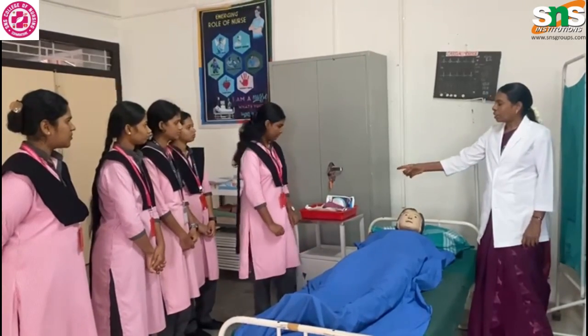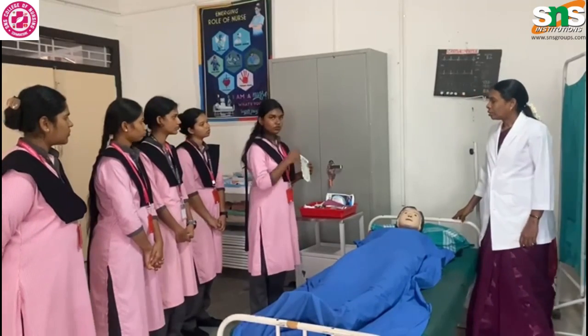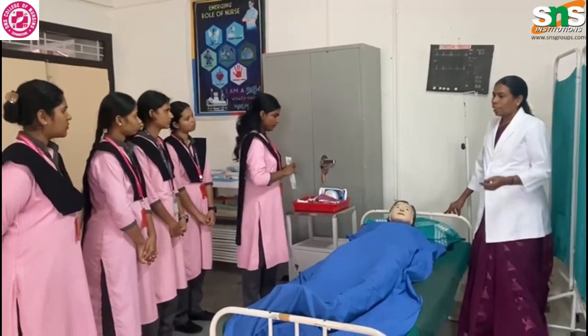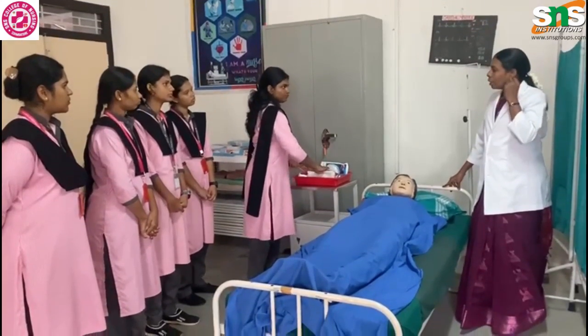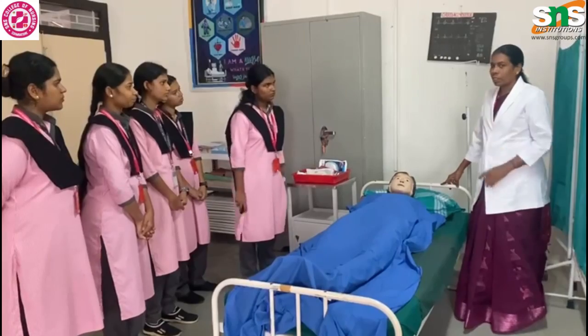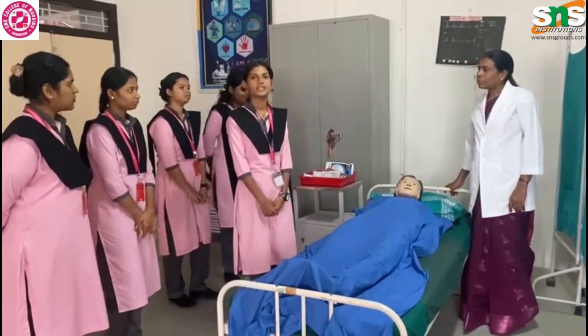Then how will we measure the NG tube? We will be measuring the NG tube from nose to earlobe and from earlobe to xiphoid process. Yeah, that is tip of the nose to earlobe and earlobe to the distal end, the xiphoid process. Yes. Next.